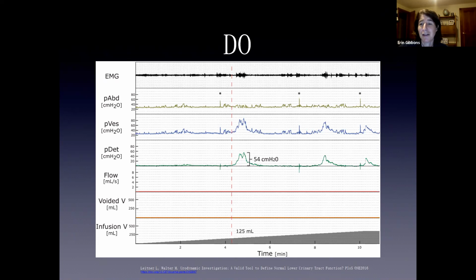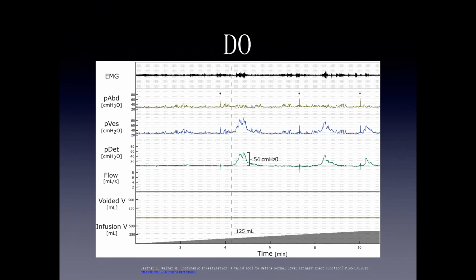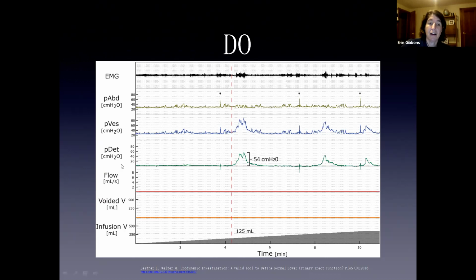And if you have a gentleman where it's coming out in a pretty weak stream, and he went 50 milliliters and his post void is 150, then he probably has low flow and he probably has bladder outlet obstruction, right? He has high detrusor contraction and low flow. Probably the first step in terms of urodynamics would be having just a Uroflow machine. Which is obviously pretty cheap, and you can get a lot of information from that.